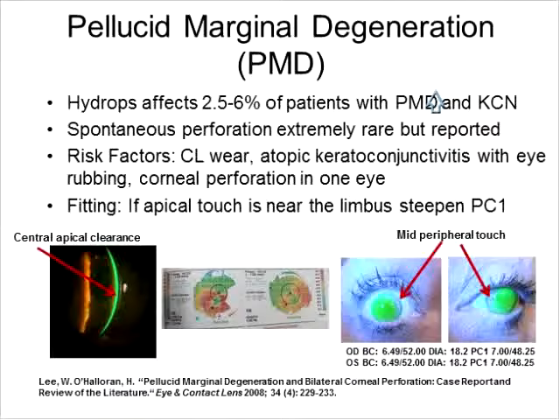Well, in that example that I showed you, and I had two cases recently where I have fit a front surface toric design, I basically do the over-refraction, and when I know for certain that it is residual astigmatism, then when I'm talking to the lab, I will let them know the amount of residual astigmatism, and then the lab will actually lay the front surface toric onto the lens itself.